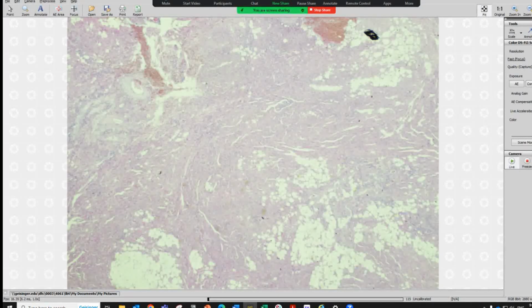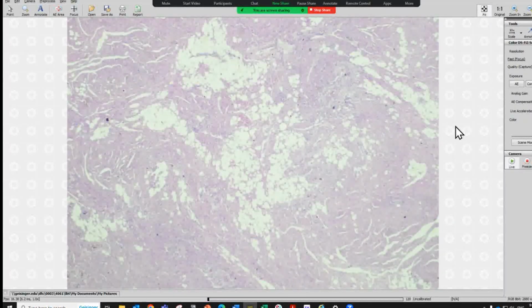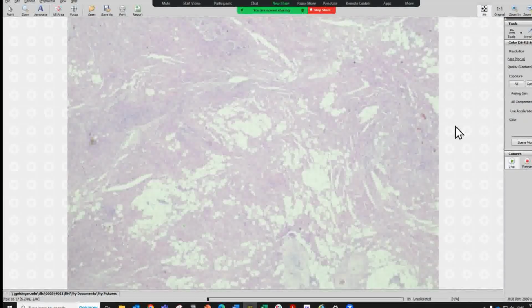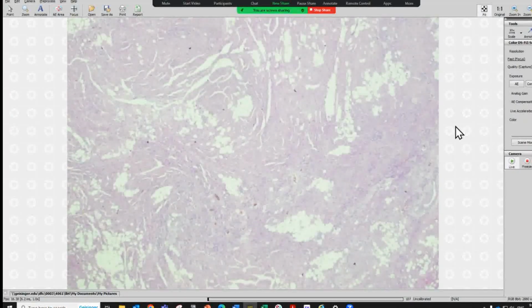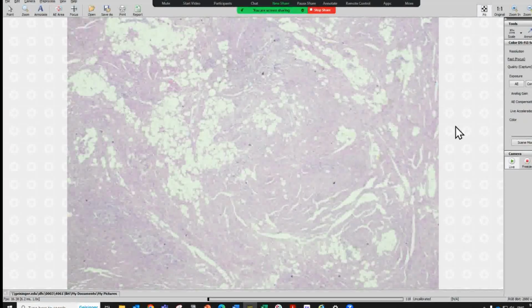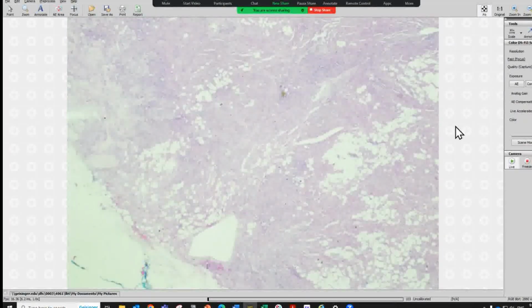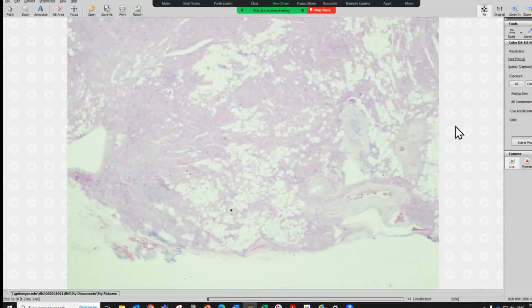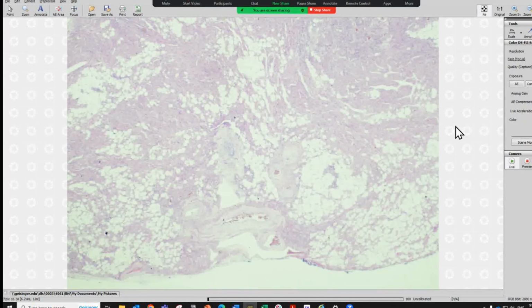This one is also from the kidney, but I do not have normal tissue to show. Again, just low power, screening the whole slide. I think this slide is really realistic, because in the kidney you rarely see a tumor with this many adipose cells, fat tissue. Let's focus on this area. I think everyone should know this diagnosis.